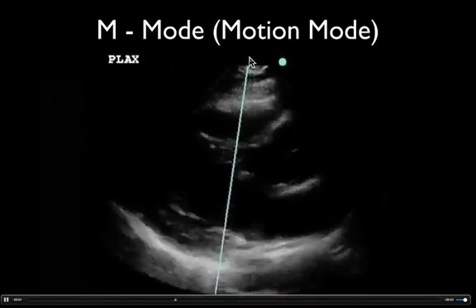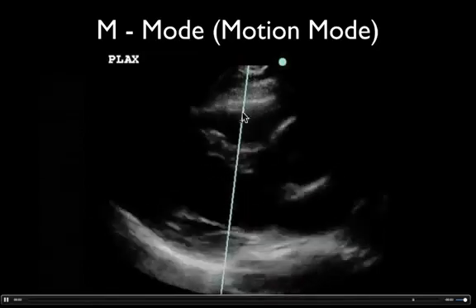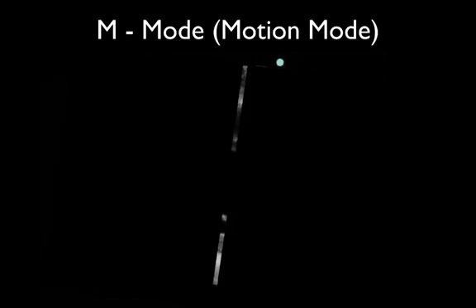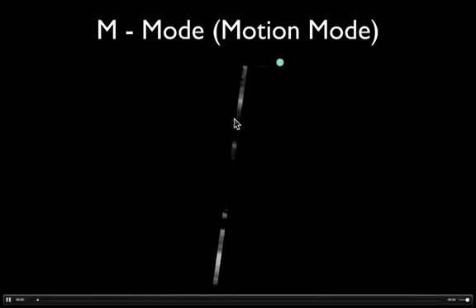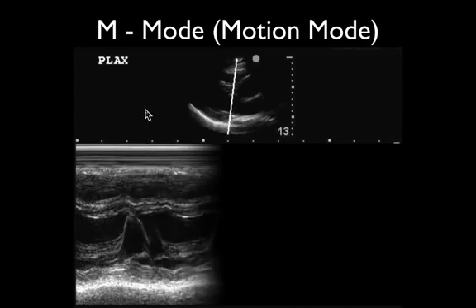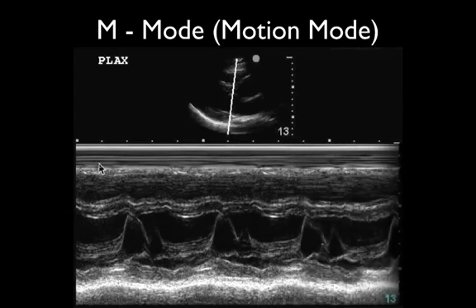What we have to think of is that now we're only going to worry about the ultrasound beam that's coming down right here, and we're going to ignore everything else. What we're going to get is essentially a line like this. We don't care about what's going on around the rest of the machine, but we want to know what's happening along this one line over time. We can't tell that by just looking here, but we can get a tracing, and it's going to go from left to right on the screen, from time zero over time. Remember, we were only visualizing along this line.